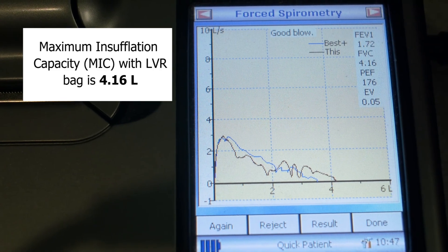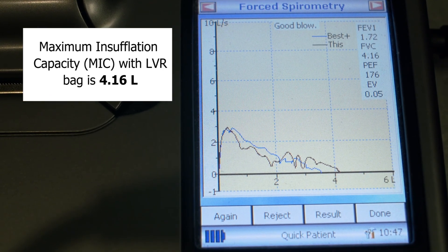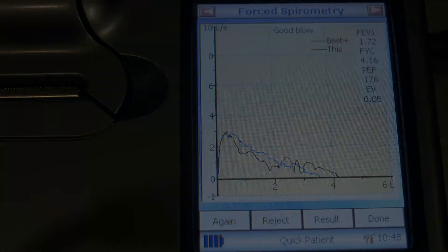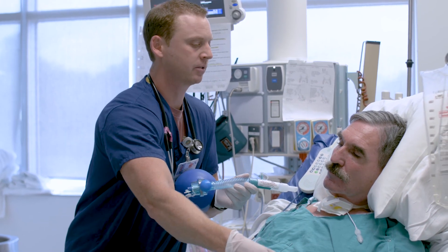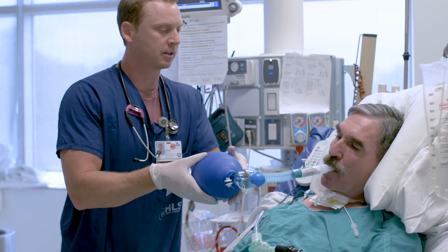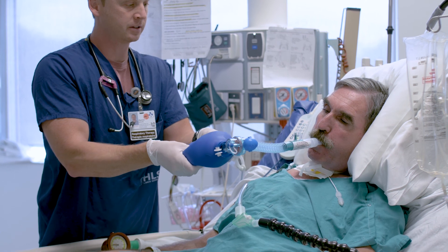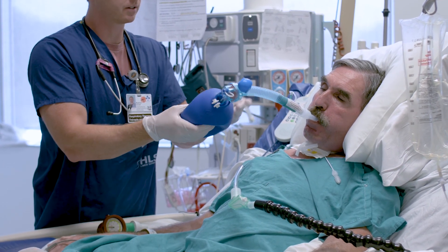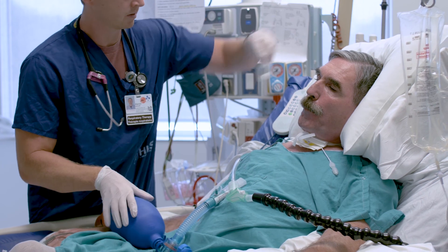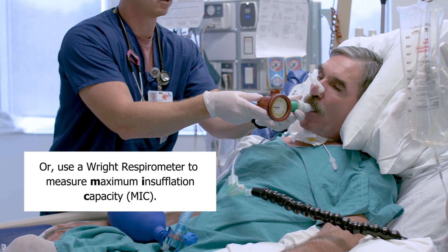And Greg, your volume is with the manual bag — 4.16 liters. Greg, we're going to do breath stacking with the manual bag. Move this from your mouth. Breath one, breath two, breath three, breath four, breath five. And blow out.